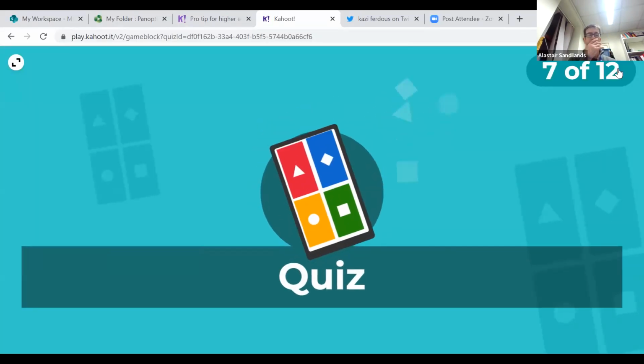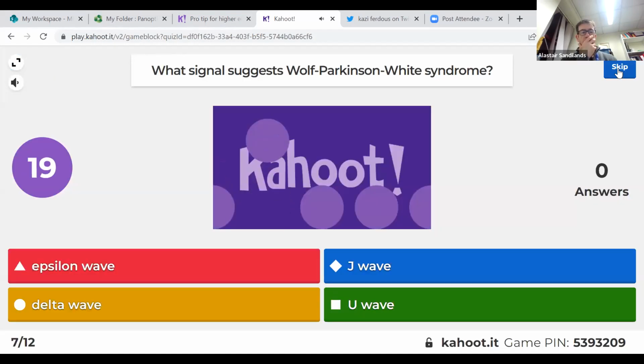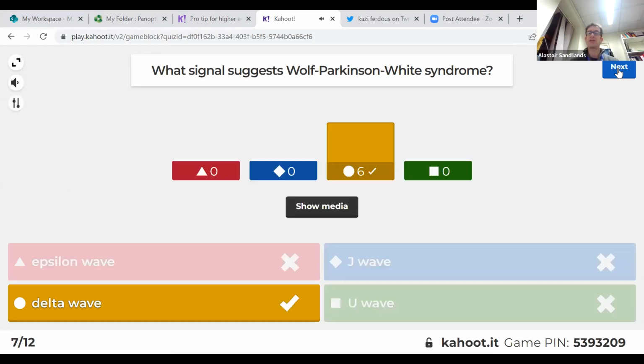Questions 7 to 9. Yeah, so it's a delta wave.